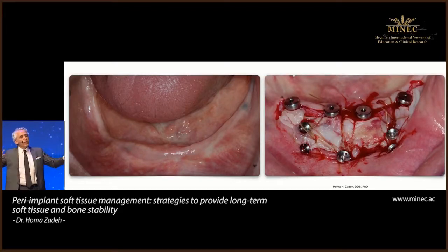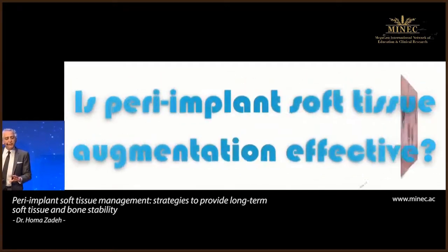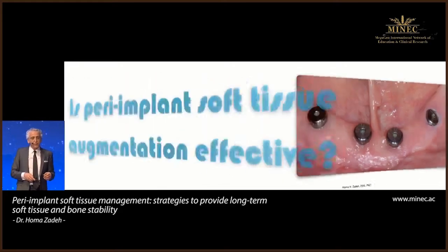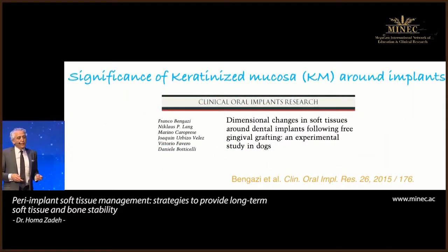So you see, we establish a zone that's just covered by LPRF. And you can see, after the fact, we gain a great deal of keratin, a band of keratinized mucosa that was thick and deepened the vestibule without harvesting any autogenous tissue. It's just a variation of other techniques of using collagen matrix. Now here, instead, we're using LPRF with the help of the fixation screws. So let's look at other techniques of soft tissue augmentation around implants.